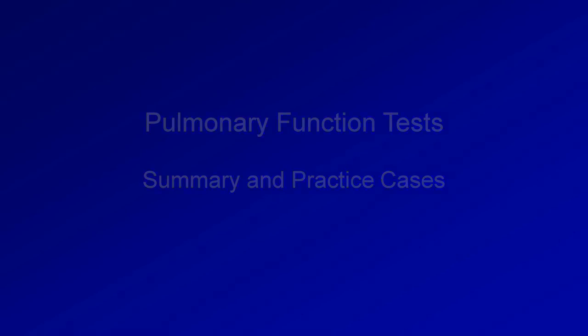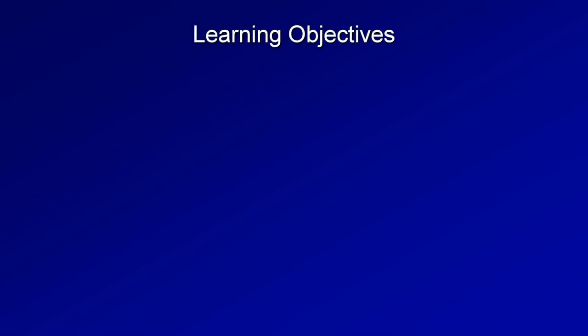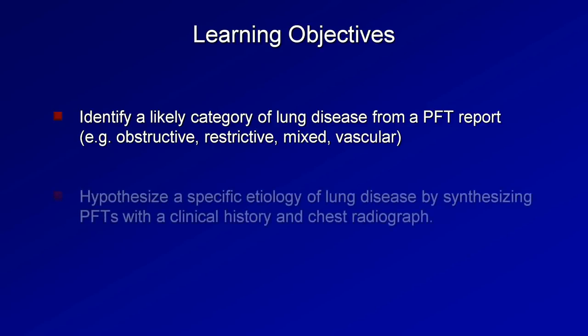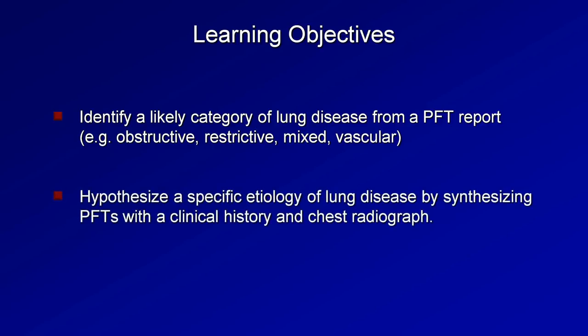report. In addition to the general review, specific learning objectives from the practice cases are first, to be able to identify a likely category of lung disease from a PFT report, and second, to be able to hypothesize a specific etiology of lung disease by synthesizing PFTs with a clinical history and chest radiograph.